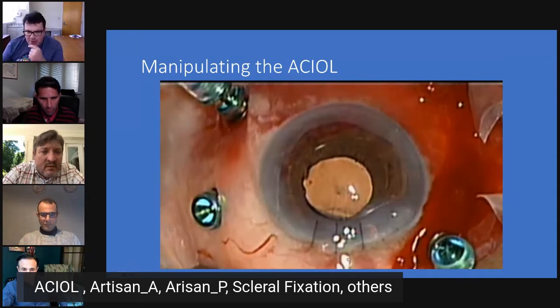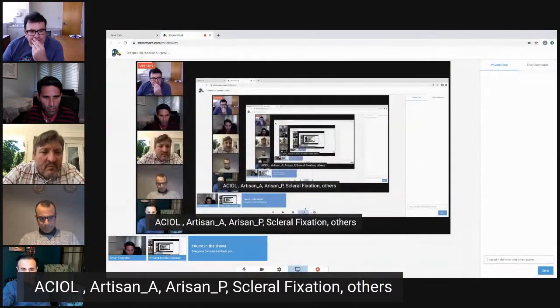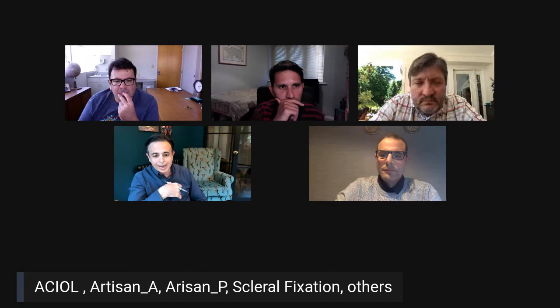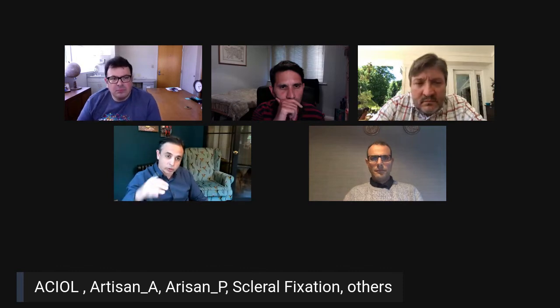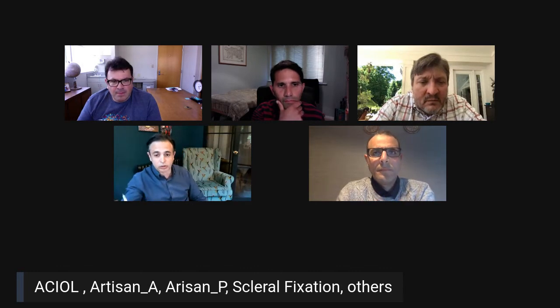Thank you, Matt. So, Felipe, do you measure white to white or use a large anterior chamber IOL? Do you do AC IOL? I stopped doing AC IOLs probably from 2010, and as Chris mentioned, I think we have much better options nowadays than to put something that's a little bit too close to the endothelium of the cornea, it wobbles. So in view of the other options that we have now, I've not put one in the last 10 years. But I used to measure the white to white and the diameter where we were going to introduce the lens, and a very similar technique to all of you. But it's definitely not something that I offer nowadays to anyone.